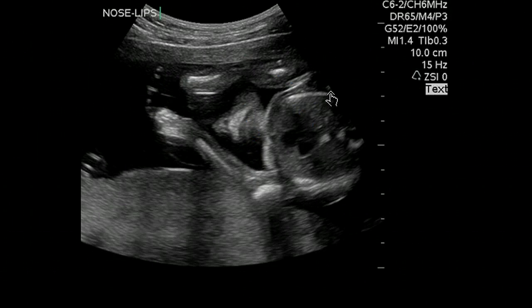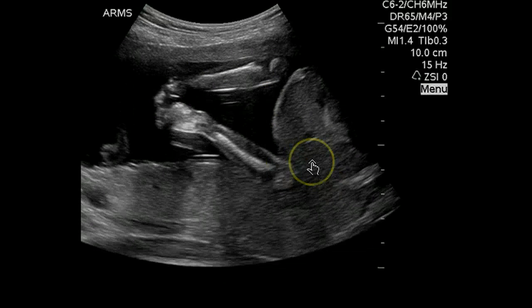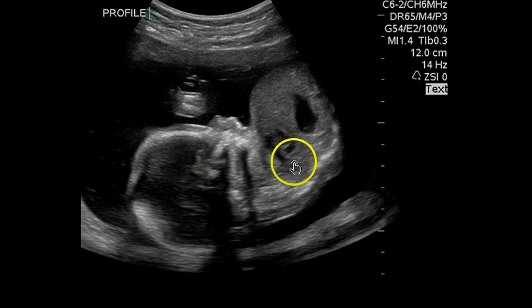Another good measurement. See the nose and lips, which is fine. Nose and lips, which looks good. Nose and lips again with arms. So we're seeing arms, we're seeing hands bilaterally, which is good. Another view of the face. The orbits look pretty normal. Profile, I always like to see the nasal bone in the profile. Looking at the chin, the lips, the nose, it looks normal.